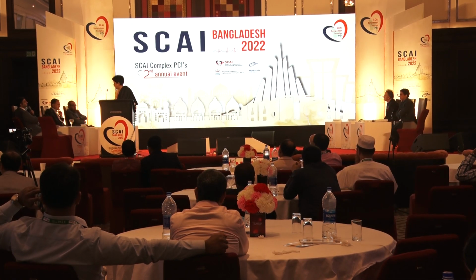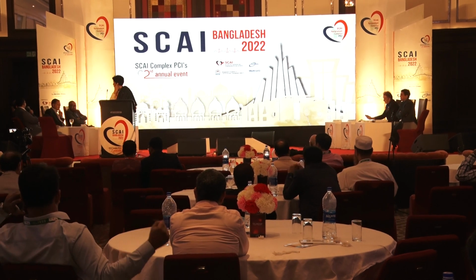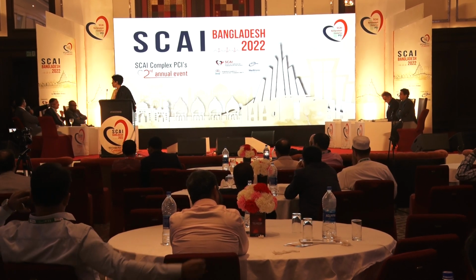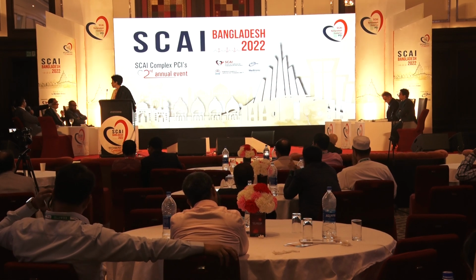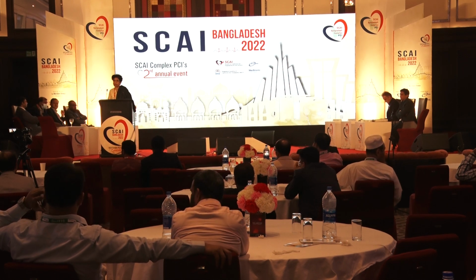Lower the blood pressure. Absolutely, you have to lower the blood pressure. Yes, so it has to be the common femoral artery where you puncture the vessel.